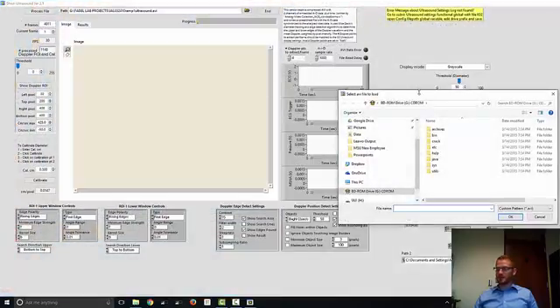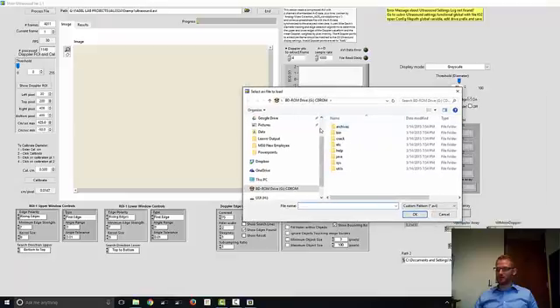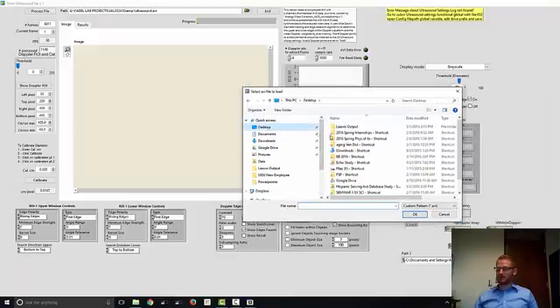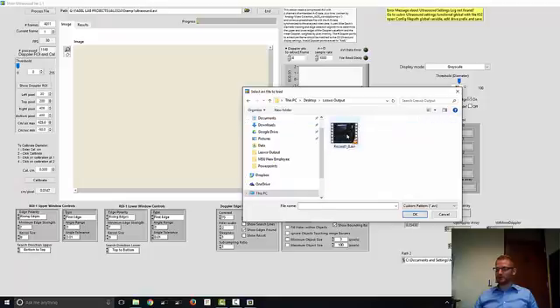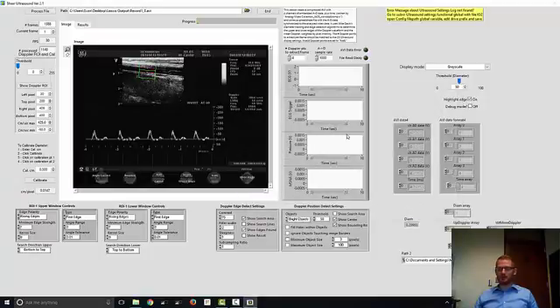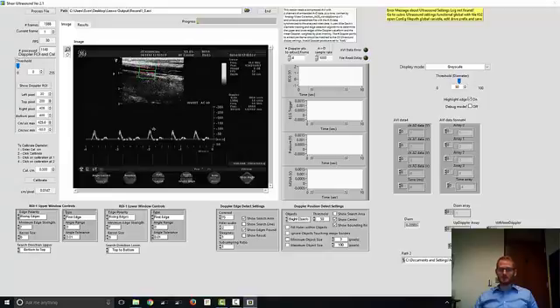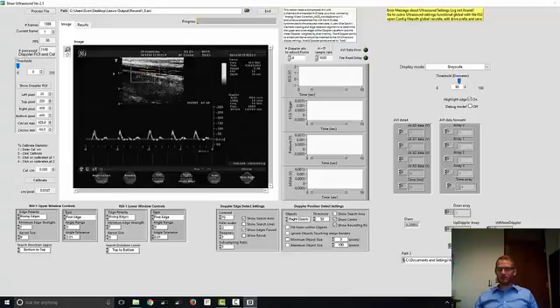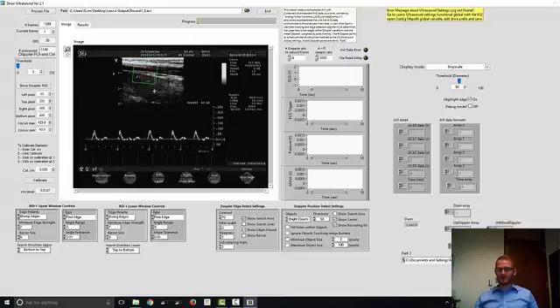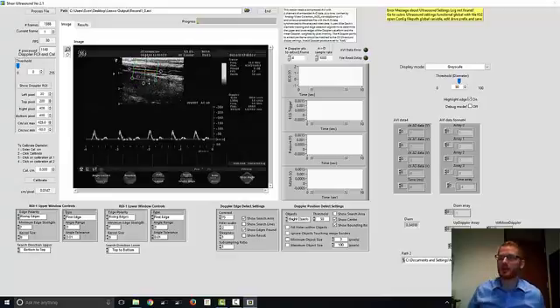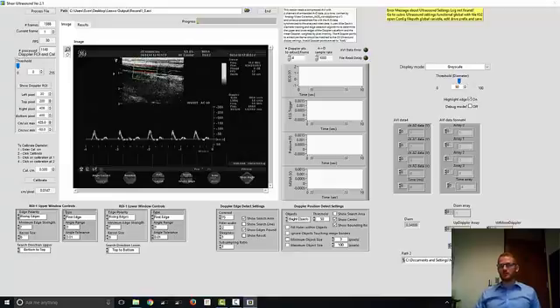That's going to bring up this dialogue to go and find the video. So let's just browse the video, and here it is. Double click to open it. This is the video we'll be analyzing. Unfortunately, the ultrasound I'm using does give you this side and bottom part of the video screen when you record the video, so it does make the image as well as the Doppler signal a little smaller than what I would like, but it still does the job. The first thing that you'll do is you want to come in here and draw a box over the portion of the vessel that you want to analyze.